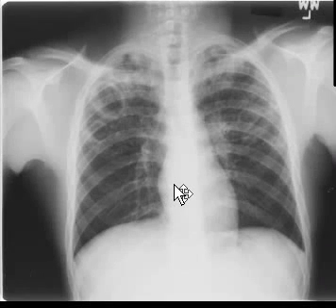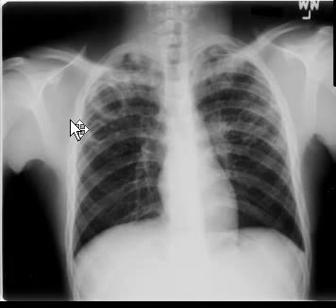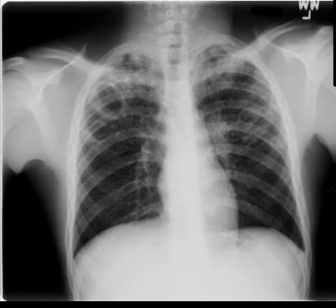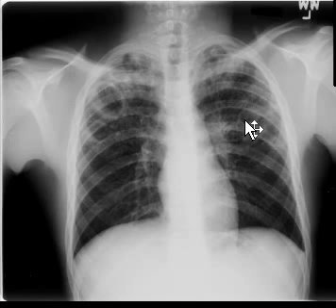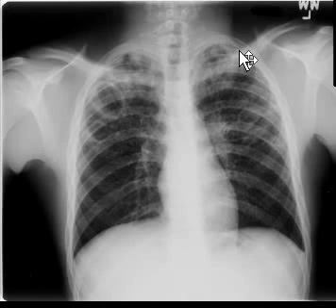This is a chest X-ray of a 15-year-old male with a history of cough. The X-ray clearly shows two well-defined thin-walled air-filled cavities in the right upper lung, and at least one cavity in the left upper lung as well. There is fibrosis and pleural changes in both upper lung fields.